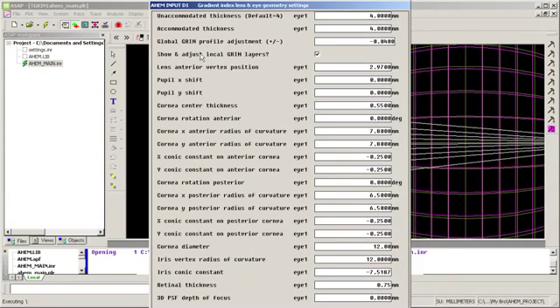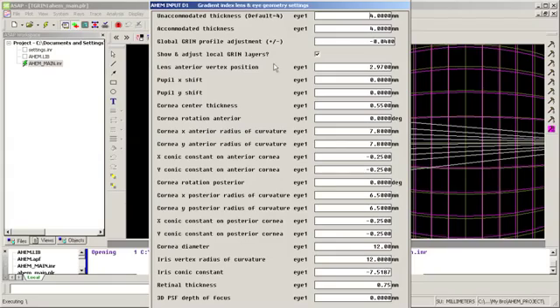I click OK, and I've got my next splash screen that's more dedicated to the gradient index lens geometry settings.